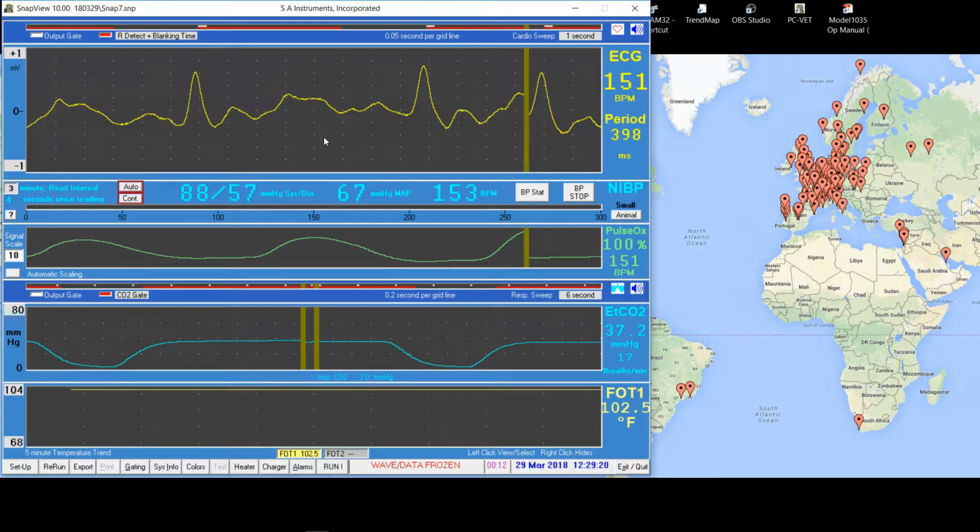Blood is ionic and an electrical conductor. As blood flows in the presence of a strong magnetic field, an electrical potential is generated that superimposes with the animal's normal electrocardiogram. This blood flow artifact occurs in the T region, and it can be quite large. It's largest with larger animals and higher magnetic fields, and negates the possibility of doing ST segmentation.